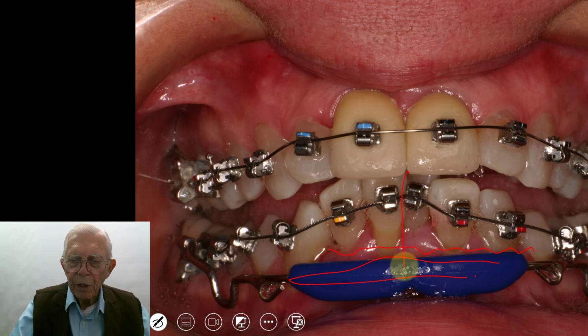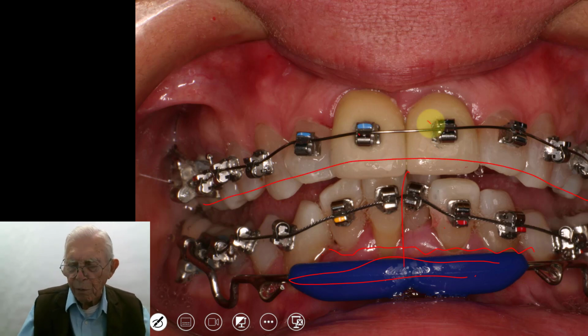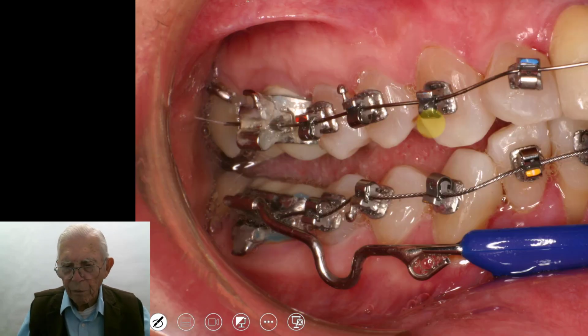And we've got the uppers lined up pretty good in here. These are crowns that we've got on here. And in adult orthodontics, you're going to run into a lot of this stuff. Now, let me get over here.